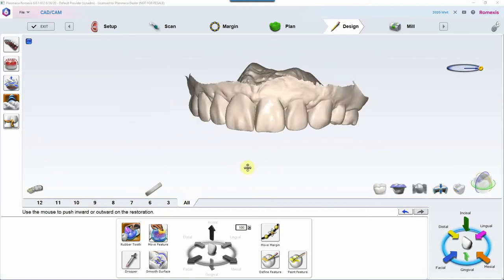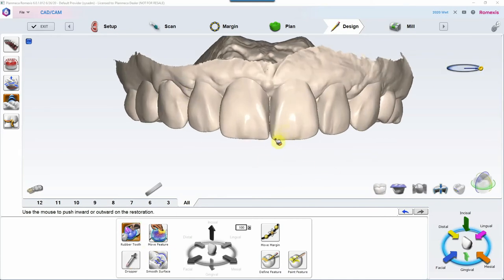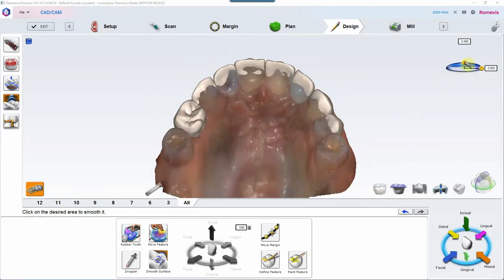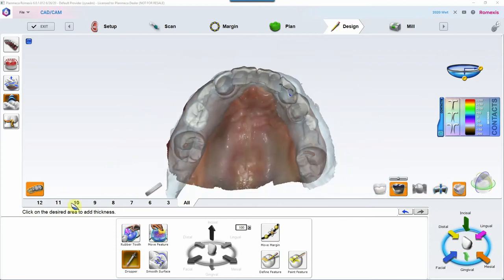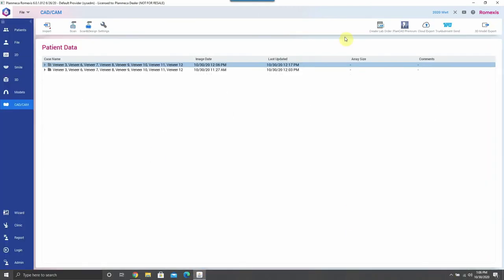And so from this, it's also open. I'm able to export these all as STL files, and then I'm going to combine them into one model and 3D print this. And this model will 3D print in around 18 to 20 minutes, and then we'll go ahead and make a putty wash of it and transfer it to the patient's mouth all in the same appointment.